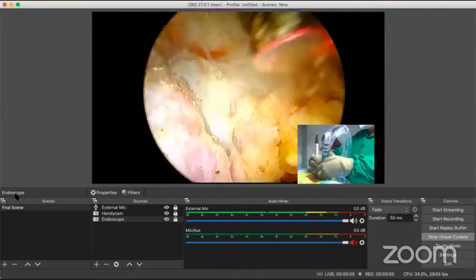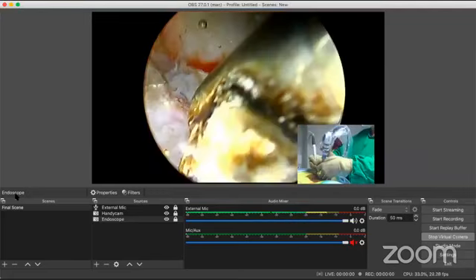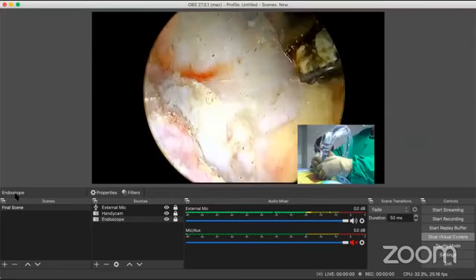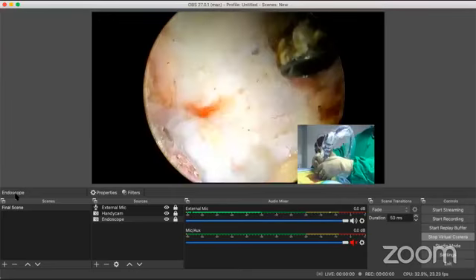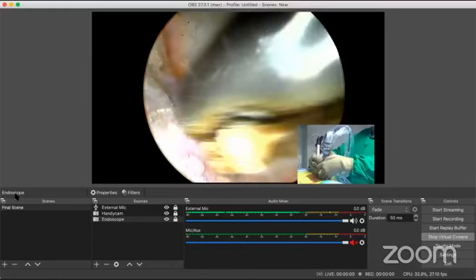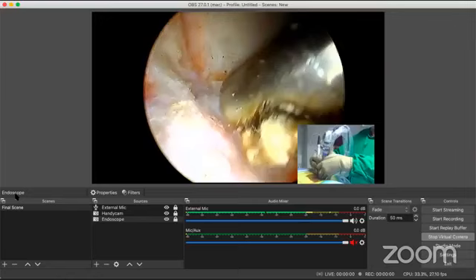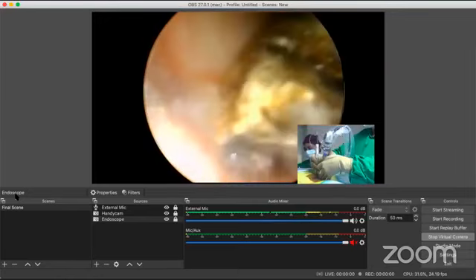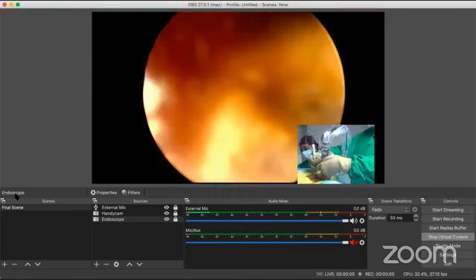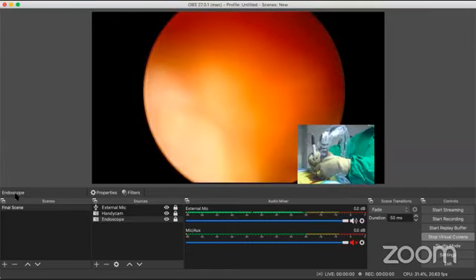Now as I come down, you can see very nicely all the tissues. Can you now start firing the blue? Now we're going to do a little bit of coagulation and bleeding control. We want tissues to be demarcated. We want the facet joint to be demarcated. Yes, yes. They're changing the fluid. And actually that helps me because it tells me where the bleeders are. Come on, fluid again, please. Yeah, thank you.